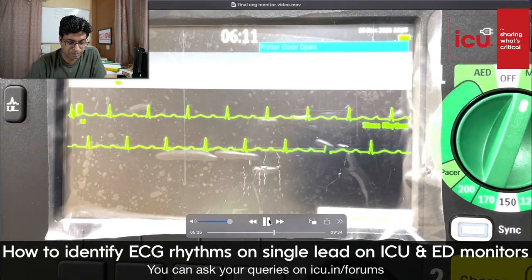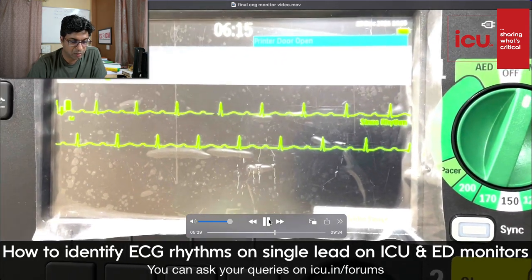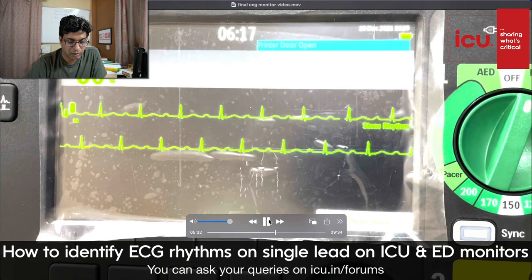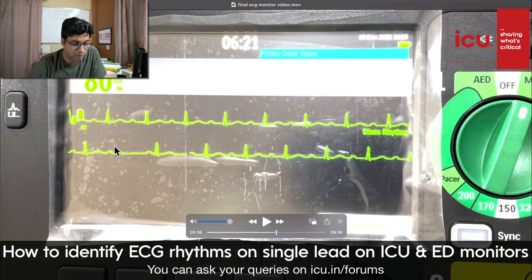Okay. Now let's see what happens. Oh, sir. One beat has dropped. What happened? We need to see.